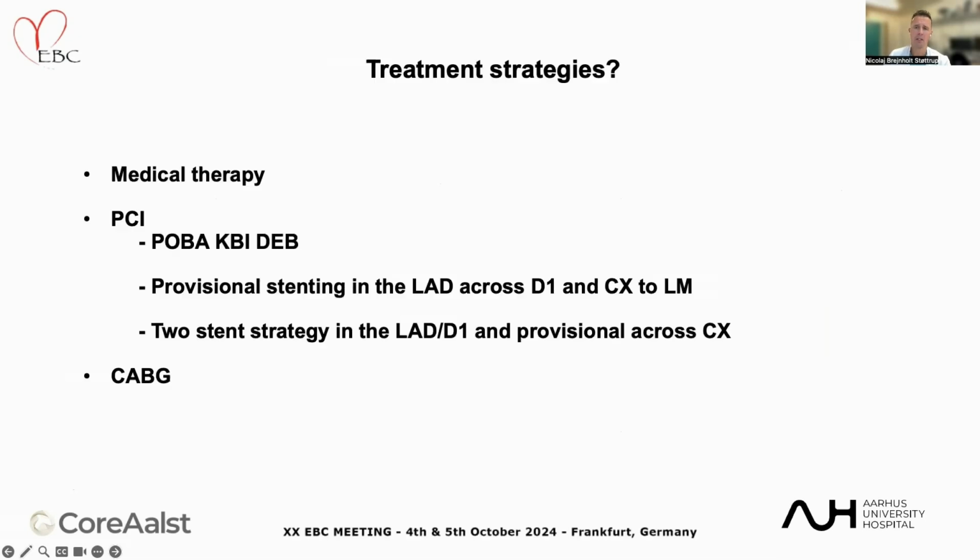So based on this information, there are a variety of different treatment strategies involving the possibility of medical therapy, different PCI approaches from balloon angioplasty, provisional stenting of main vessel to complex stenting involving a two-stent strategy in the LAD diagonal bifurcation. We chose a two-stent strategy out of a safety approach with a concern for the diagonal bifurcation, risk of severe side branch dissection during side branch pre-dilatation, and risk of difficult rewiring after a provisional attempt.